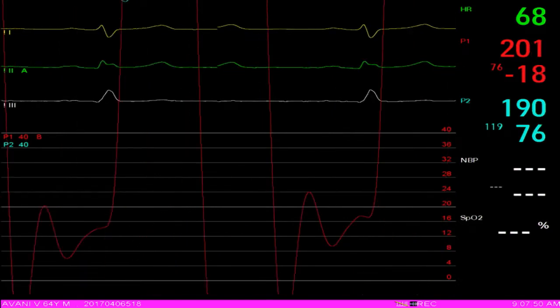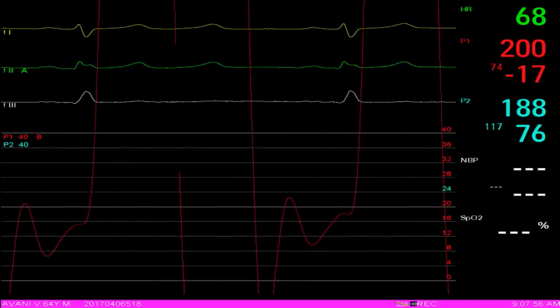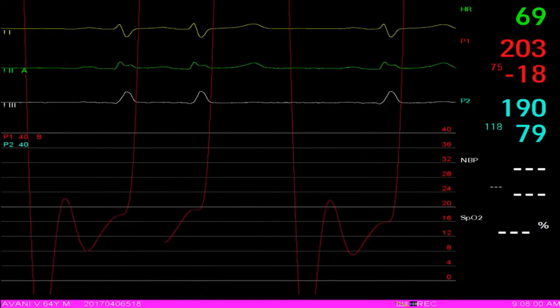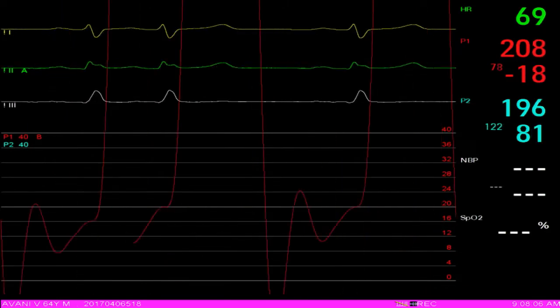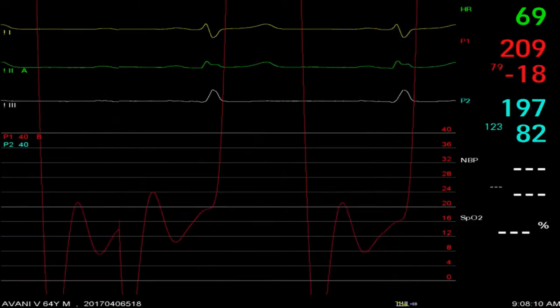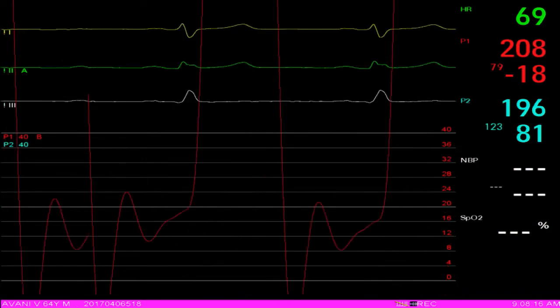If it touches 20, then what I do is give intravenous furosemide to find out whether we have given a lot of fluids. Right now it is somewhere around 18. The baseline in this patient, Dr. Raghu measured somewhere around 16. Yes, sir. So from 16 it has gone up to 18. It's not too alarming. I think I'll be able to manage this patient with medications.